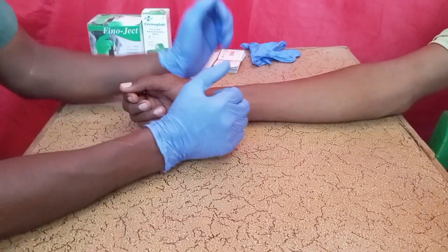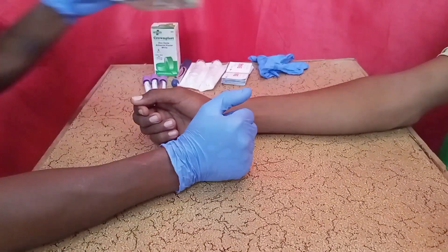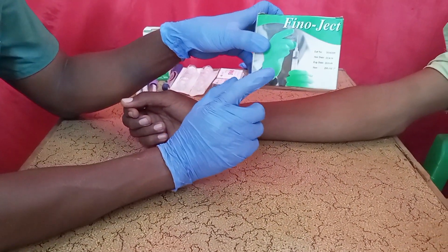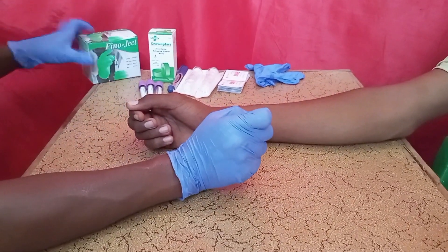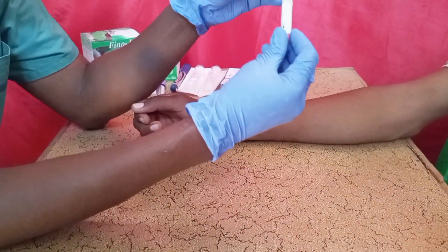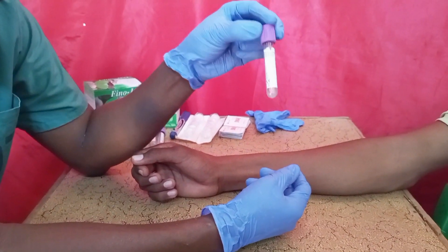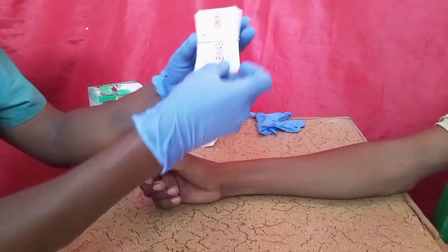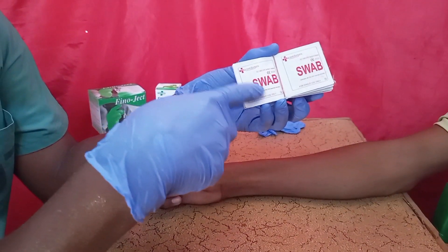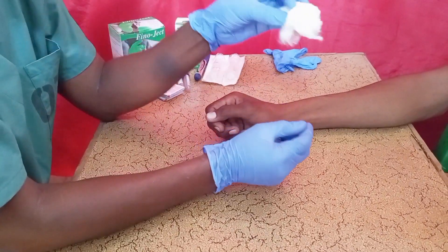You have to gather all the necessary equipment. For example, you will need a 21-gauge needle to attach to the syringe to withdraw blood from the vein. You will also need a blood collection tube and an alcohol swab to clean the vein.